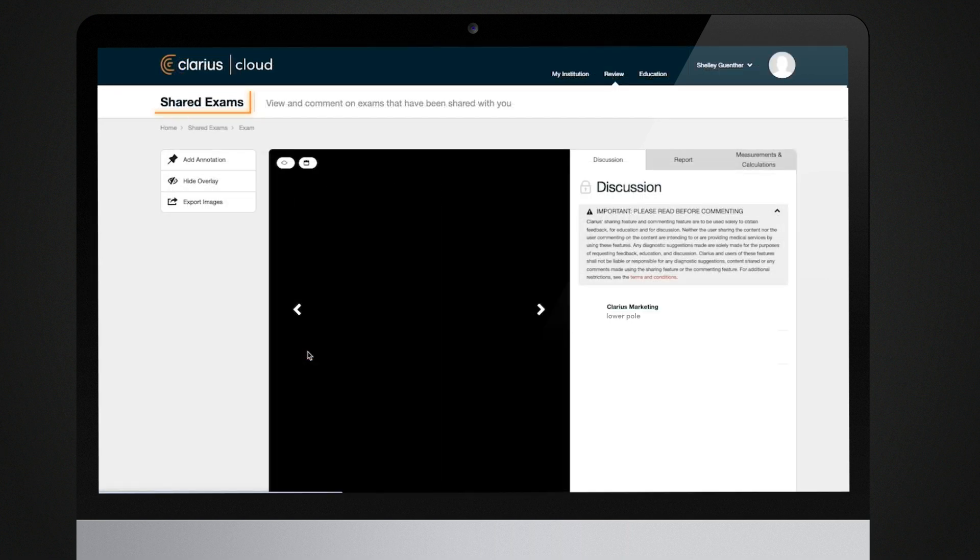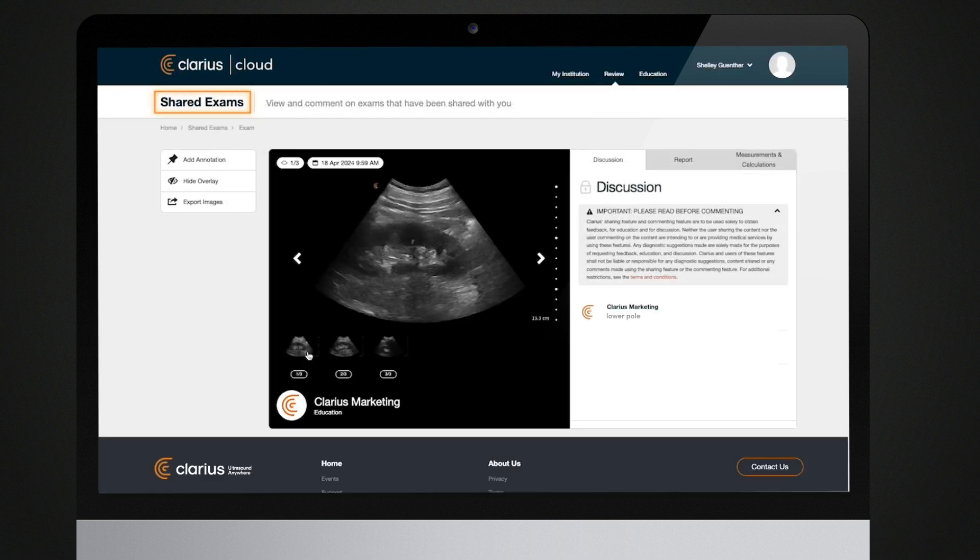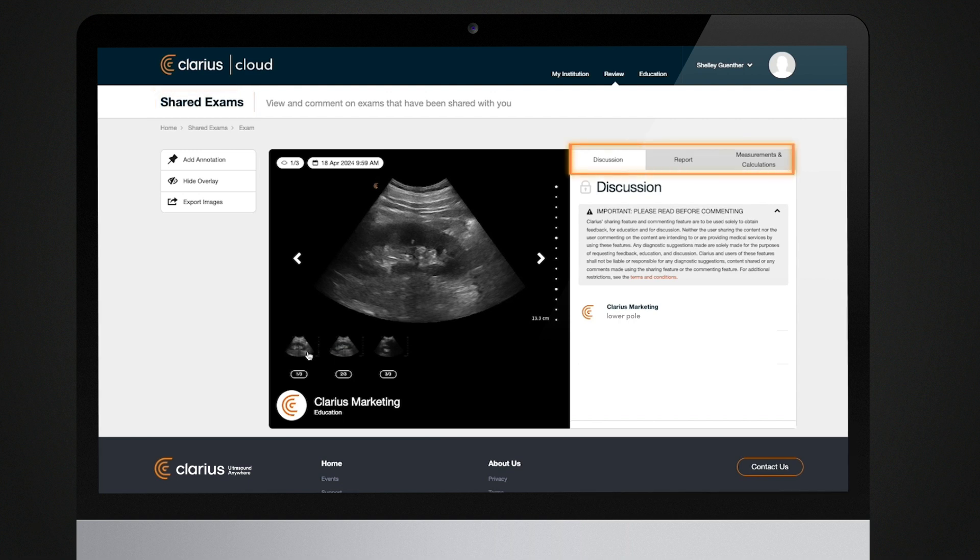When you share images, measurements, and findings with others, sensitive patient information is not shared. This enables collaboration, education, statistics, and provides other tools to enhance patient care while maintaining patient confidentiality.